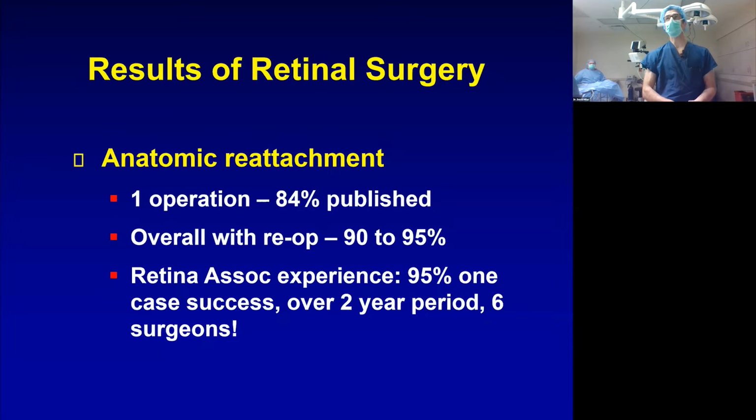How about the results of retinal surgery? Well, the anatomic reattachment, one operation, is about 84% published in most of the literature, with an overall success rate of 90 to 95% if it takes multiple surgeries. In our practice at Retina Associates of Cleveland, our experience done recently and presented at a meeting was 95% with one case success, studied over a 2-year period for 6 different surgeons.